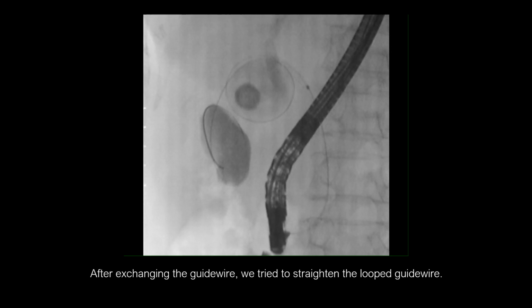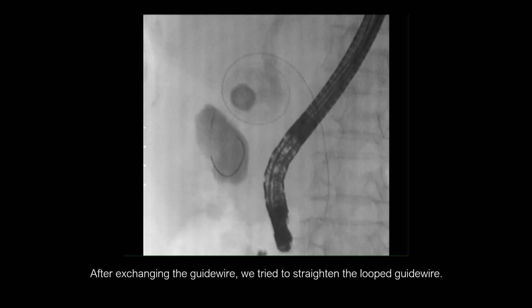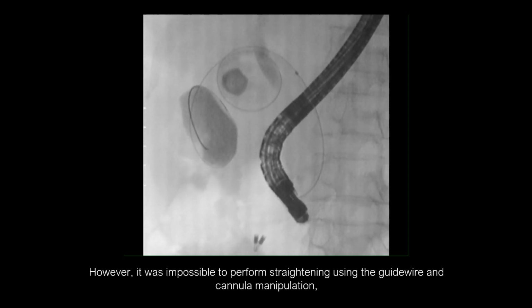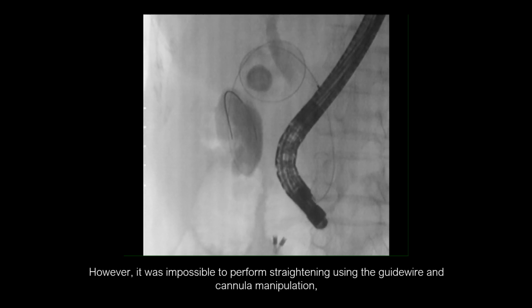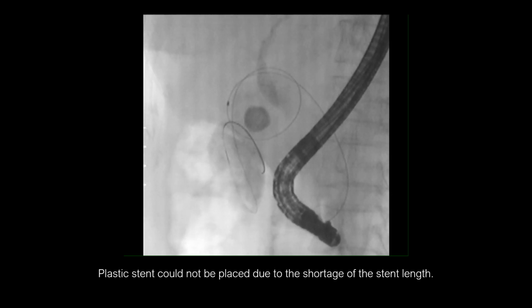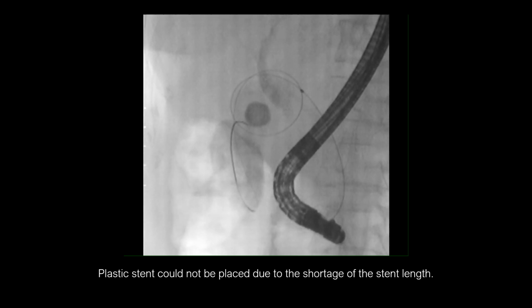After exchanging the guide wire, we tried to straighten the looped guide wire. However, it was impossible to perform straightening using the guide wire and cannula manipulation, and the plastic stent could not be placed due to the shortage of the stent length.